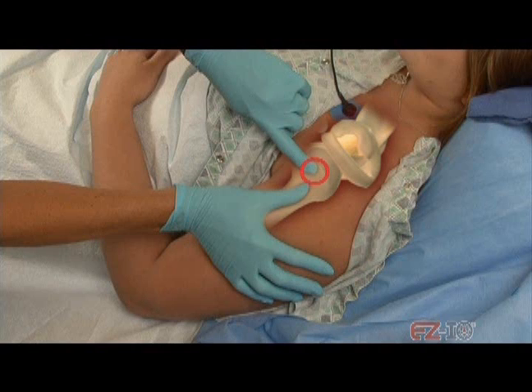VIDACARE recommends the 45 millimeter needle on patients weighing more than 40 kilograms. The humerus is the preferred site for patients who are responsive to pain. Once the insertion is completed, secure the arm in place to prevent movement and accidental dislodgement of the IO catheter.